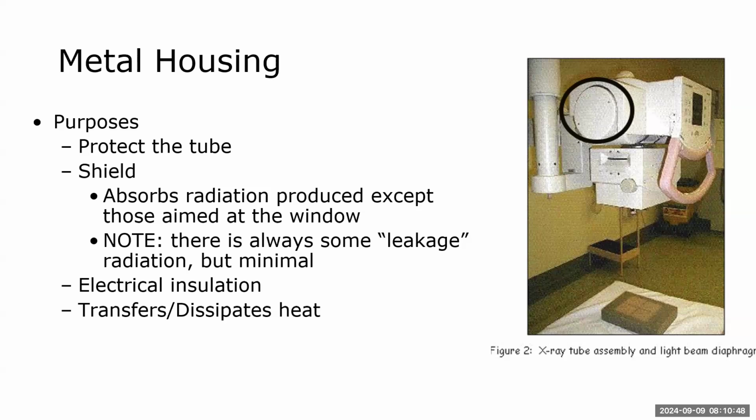From the ceiling, we have the ceiling mounted. You may have floor mounted. When you're out there in clinic, there's a couple of sites that have the tube mounted from the floor, so not quite as much flexibility as we have, where we can drag the x-ray tube all over the room.